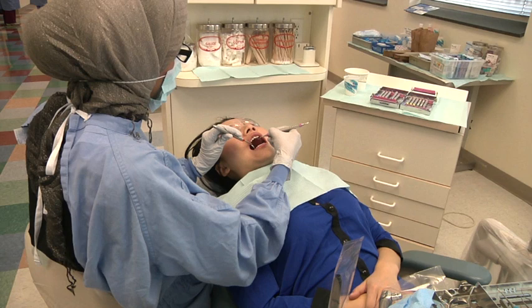Be sure that you are seated in the correct position. To determine the correct clock position for treatment of the posterior teeth, you must be able to determine the aspects of the teeth that are facing towards or away from you. To do this, you must be seated at the 9 o'clock position.